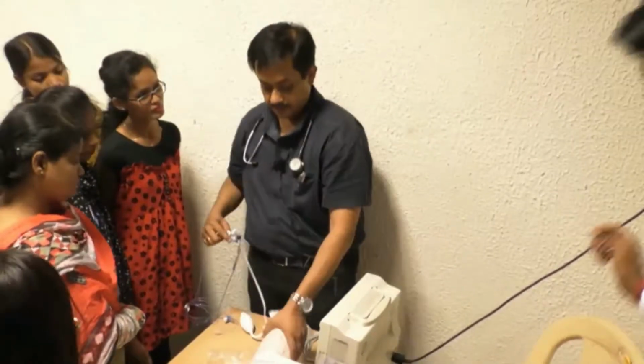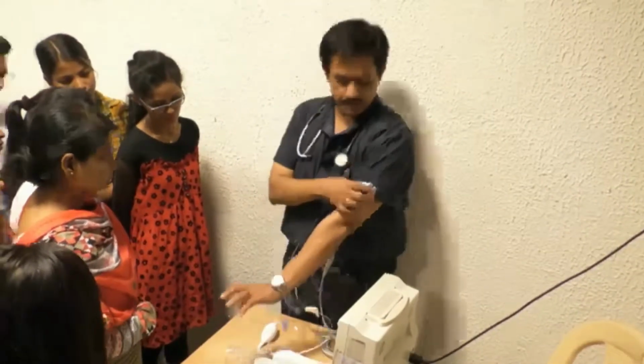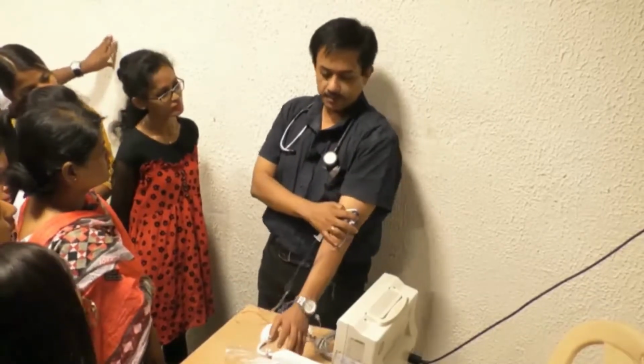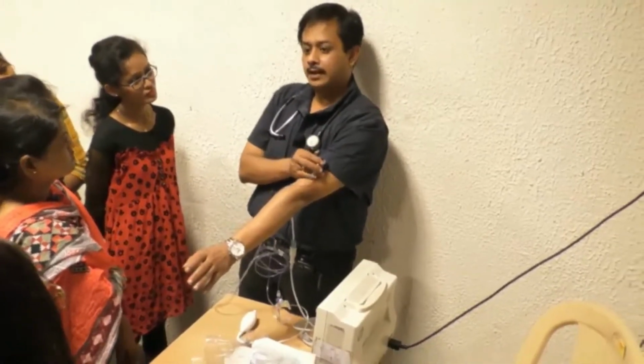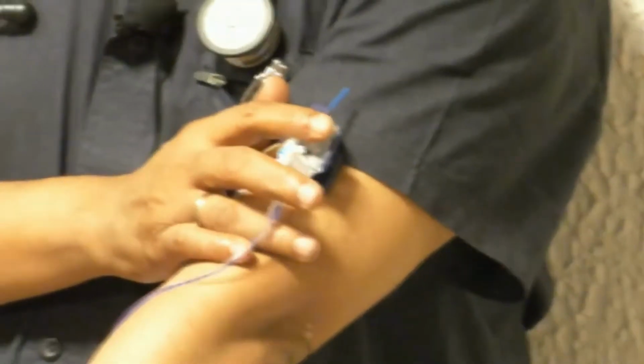Suppose this is my phlebostatic axis, it is fixed here, okay, or maybe it has slipped down here. Difficult to show, but below. Is there going to be any change in pressure recorded by the system?